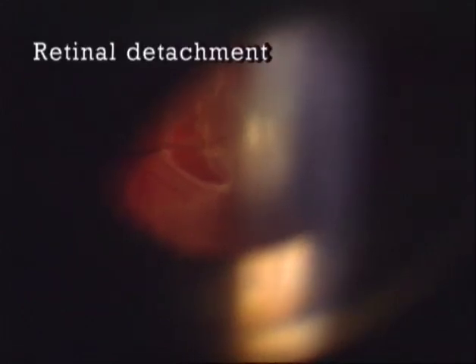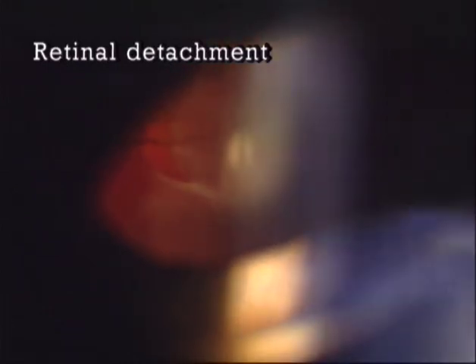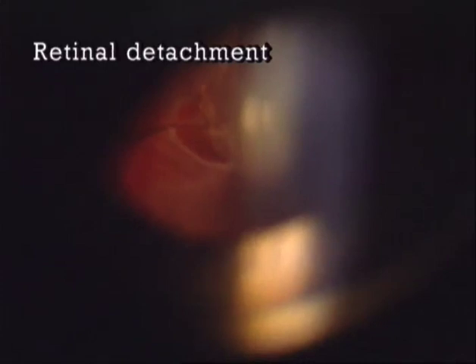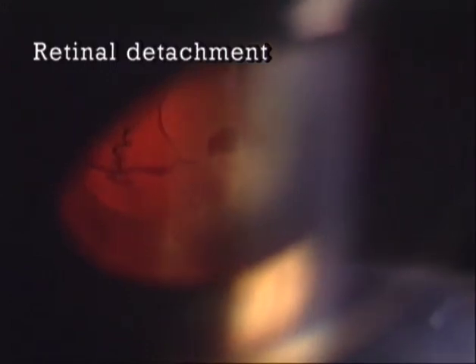For example, in this case of retinal detachment, there is a barely visible pre-retinal floater adherent to a vessel which runs across the retinal tear. This floater appears brown in direct light because it is pigmented and the vessel appears red. In retroillumination from the fundus, however, both appear plain black.